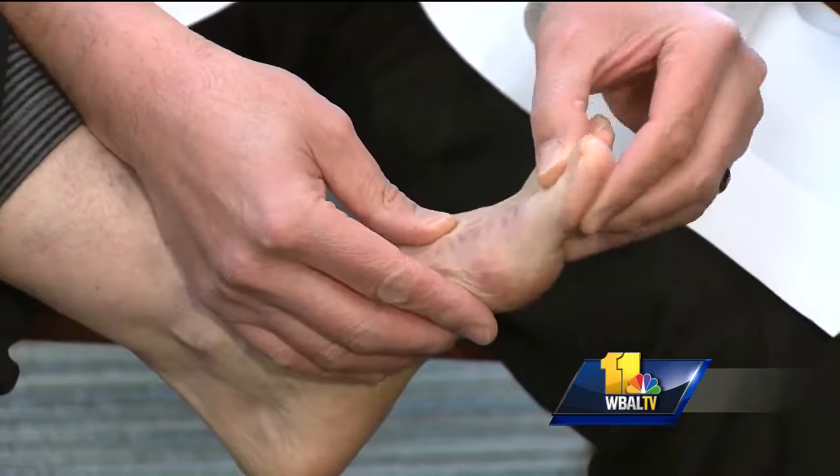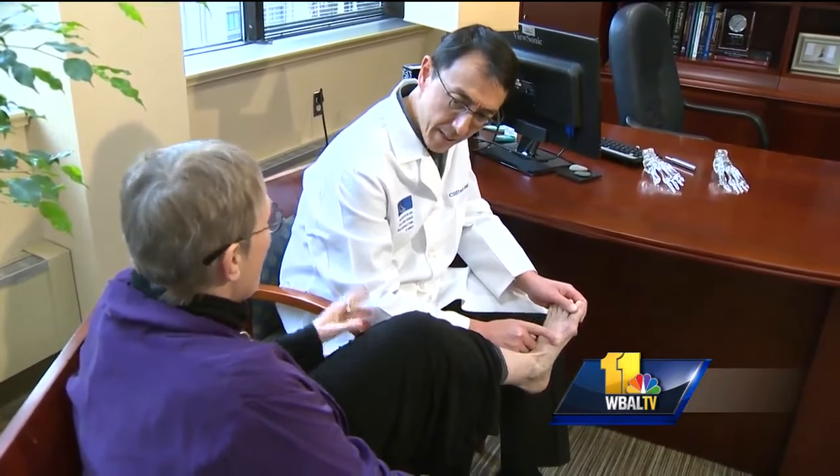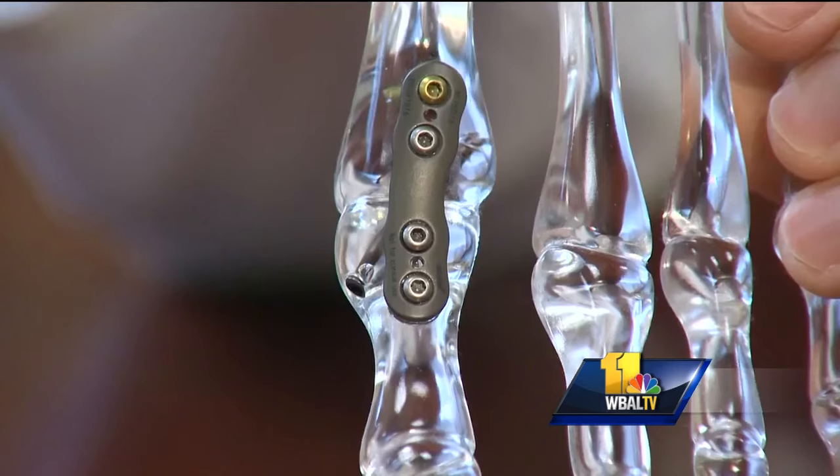She's out of pain thanks to a new surgical procedure using a synthetic cartilage implant called Cartiva. 'I saw a significant difference within hours.' Mercy Medical Center surgeon Dr. Clifford Jeng says this used to be the gold standard for treating arthritis in the big toe: fusing the joints together.